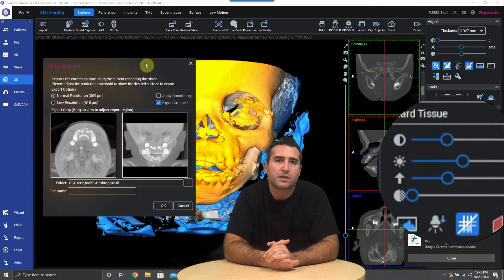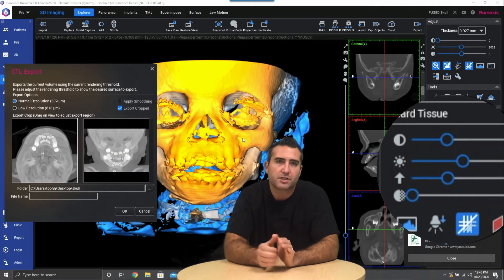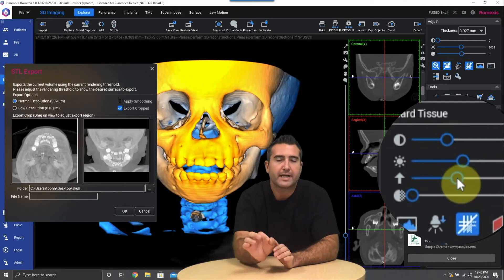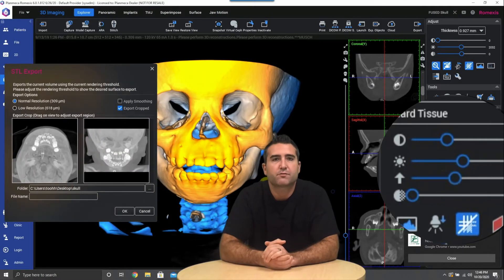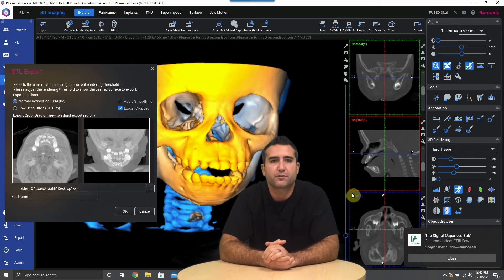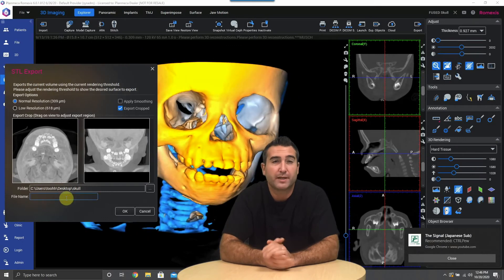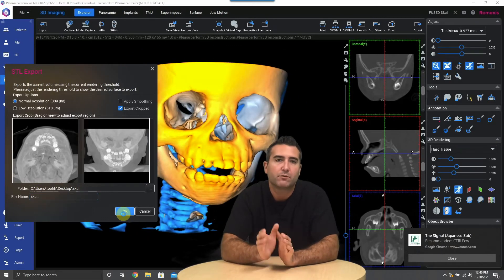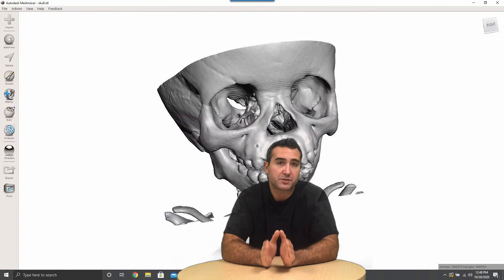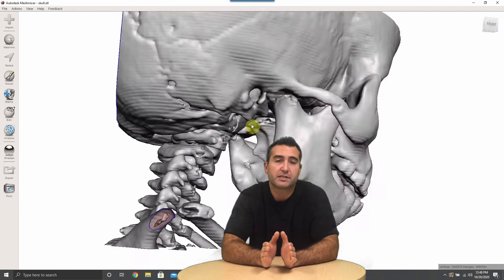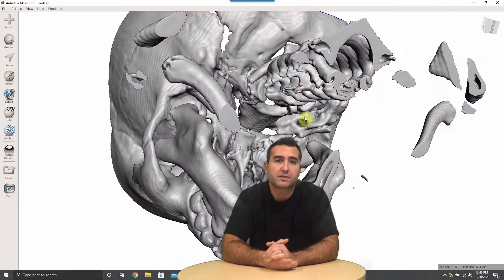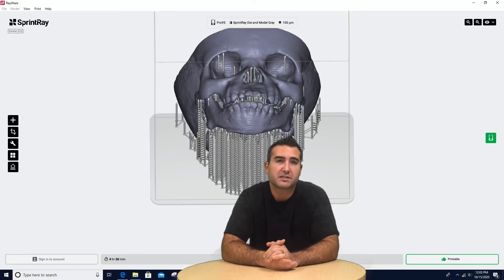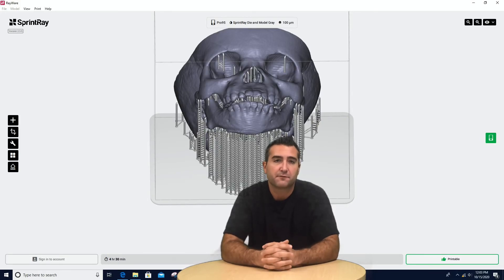Then start adjusting your threshold. It's critical that you go back and readjust your threshold in your 3D viewer by altering the up arrow there. Whatever you see on the screen is what you're going to get in your STL file when you save it.